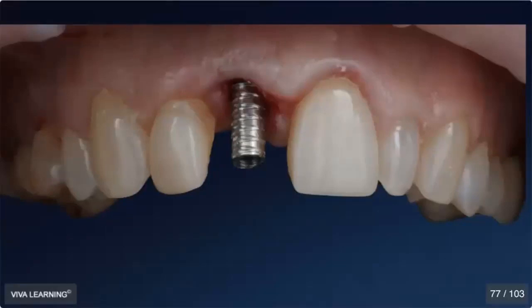And remember, we have a digital wax up. We know the position of the implant. We know that we have the intraoral scan. All of that in combination together allows us to fabricate a temporary prosthesis that we can slide right on the temporary abutment. So within the information that you have, if you're a powerful digital user, you can take that info and either 3D print or mill a temporary restoration, which is what we did in this case.